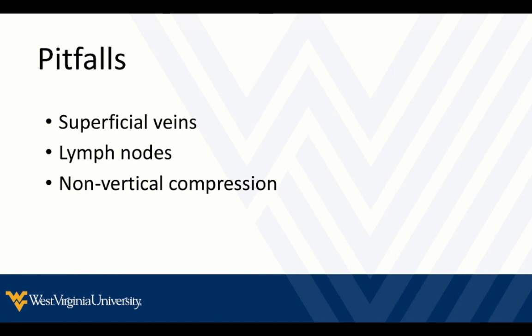And another piece is when you find these veins, you want to have your probe oriented vertically so you're pushing straight down towards the floor on them. If you don't press vertically, then you may not get complete compression and you may end up with false positives.